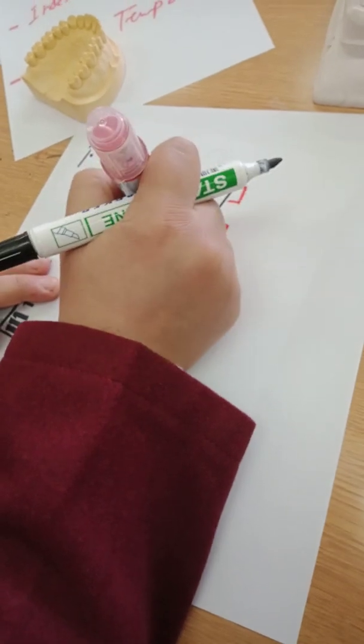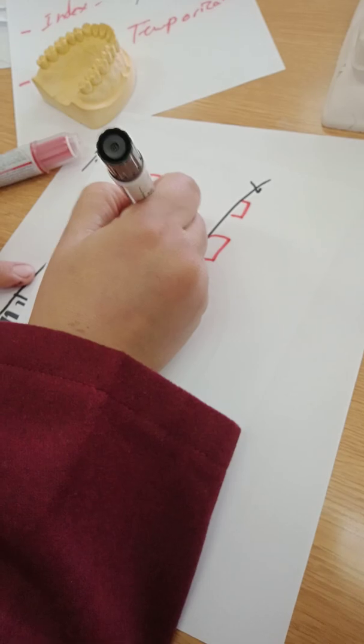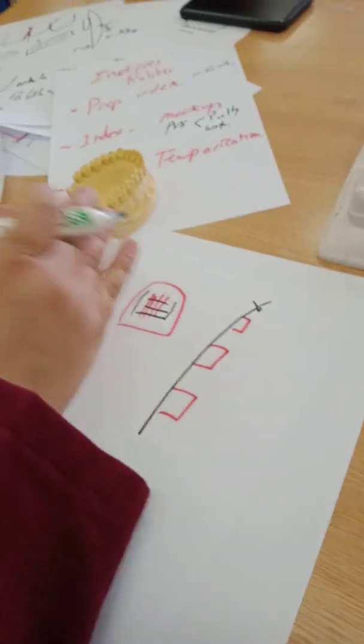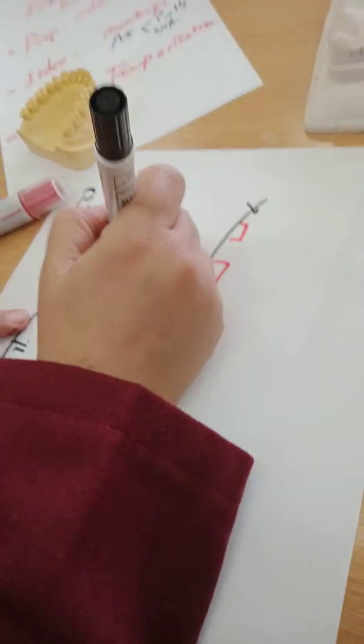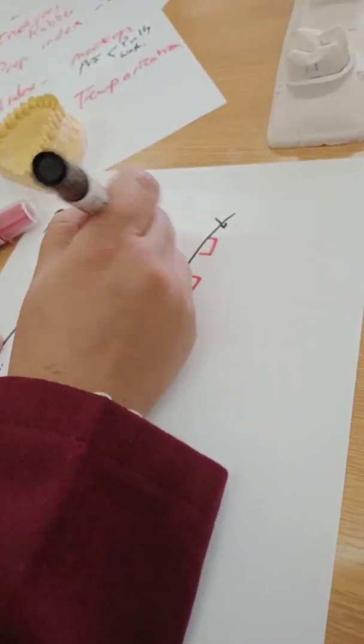Secondly, when the tooth morphology is like this, and this is the main bulge of the tooth, I find myself preparing a lot from here while minimally here, because I did not rotate my burr around. So I need to make sure I'm preparing gingivally, incisally, and midway.